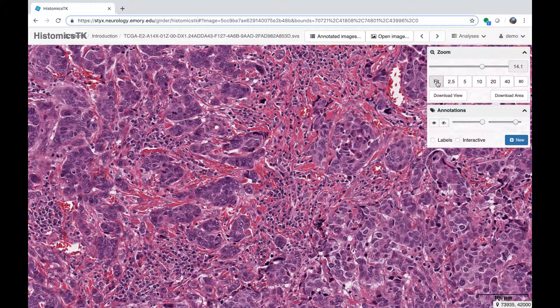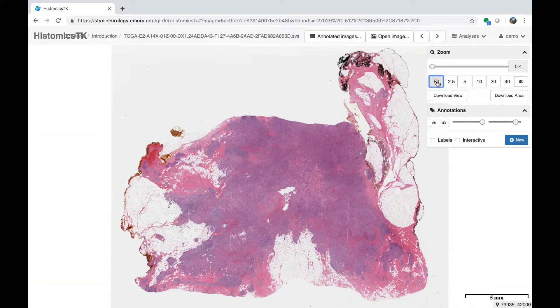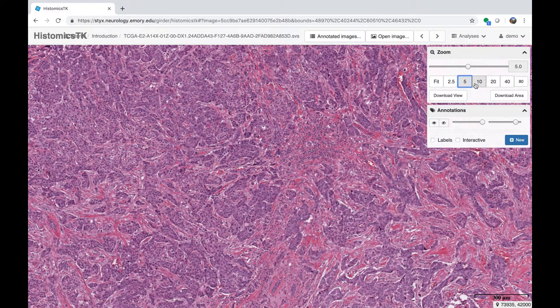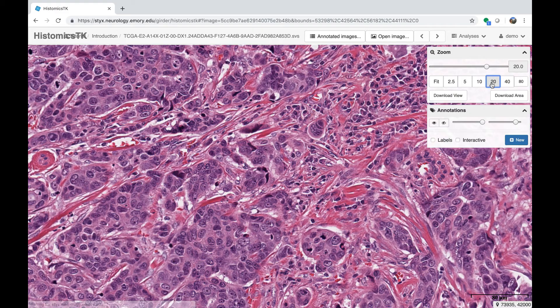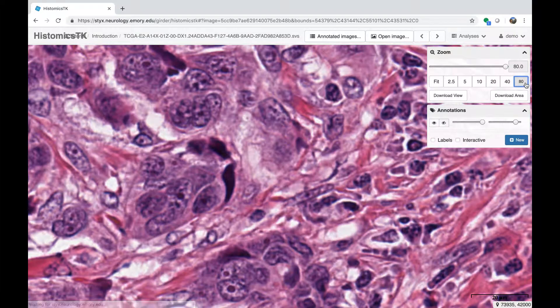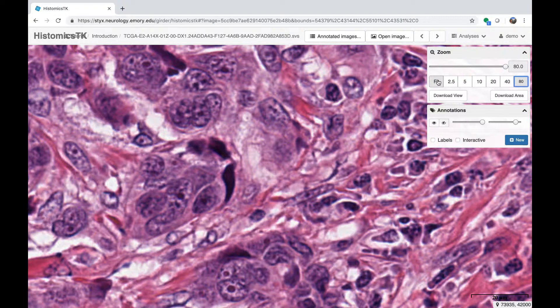The zoom bar shows the magnifications you can use. Fit just scales things to the current window. The large icons show the various magnifications native to the whole slide image. There's also a digital zoom, which is helpful for annotating very detailed structures — it can be a little blurry, but if you need to trace things, it can be helpful. You can also download the current area to generate an image or snapshot, just like a regular microscope.